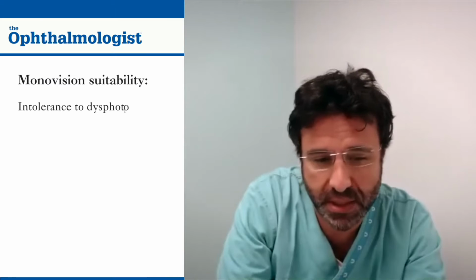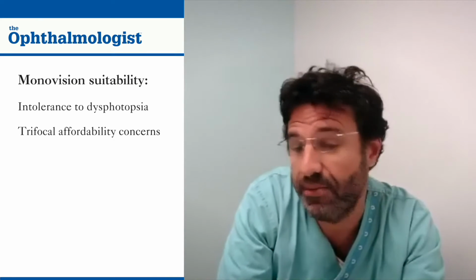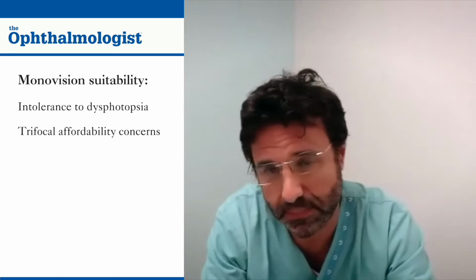Thank you for the introduction. Let's get started then. What is your patient selection criteria for monovision? Typically, patients who are not expected to tolerate dysphotopsia, as well as patients with affordability concerns about trifocal lenses.